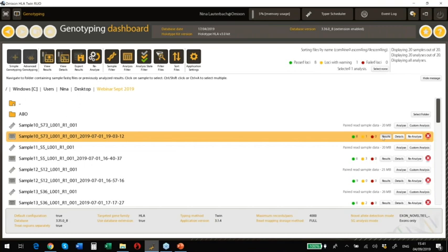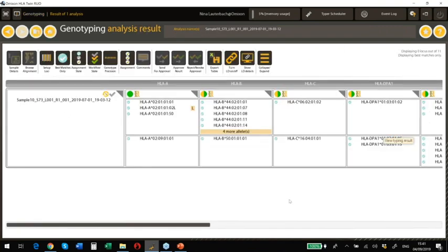So if we go to check the results, we will immediately see a big change. The experienced users know how this picture looked like before. Now we have changed the display of the results a little bit to the more table format. Some additional information has been highlighted.